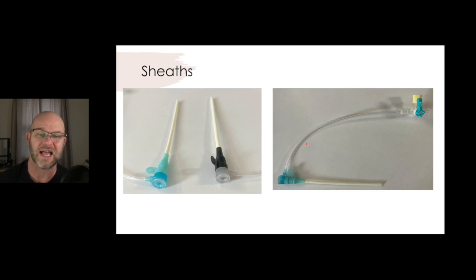These also have a side sheath that comes off, and that's where you can flush it and give certain medications within the procedure.